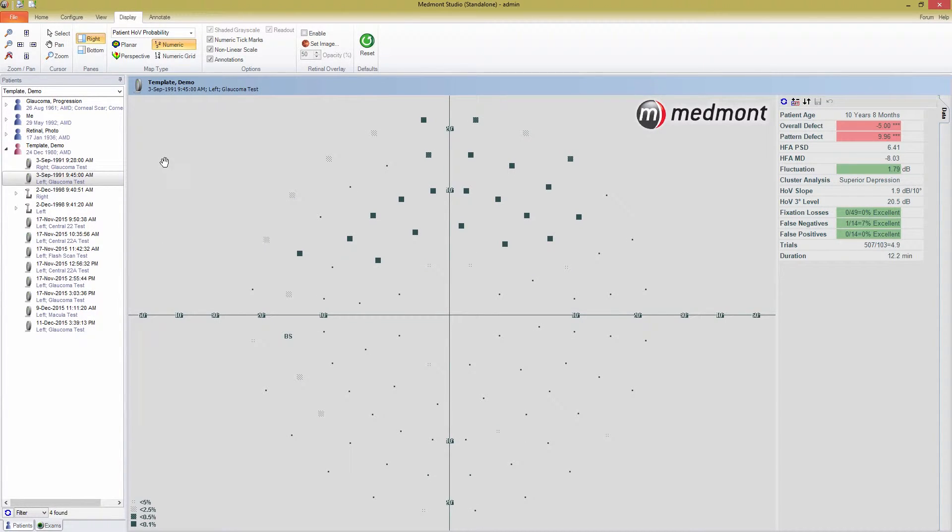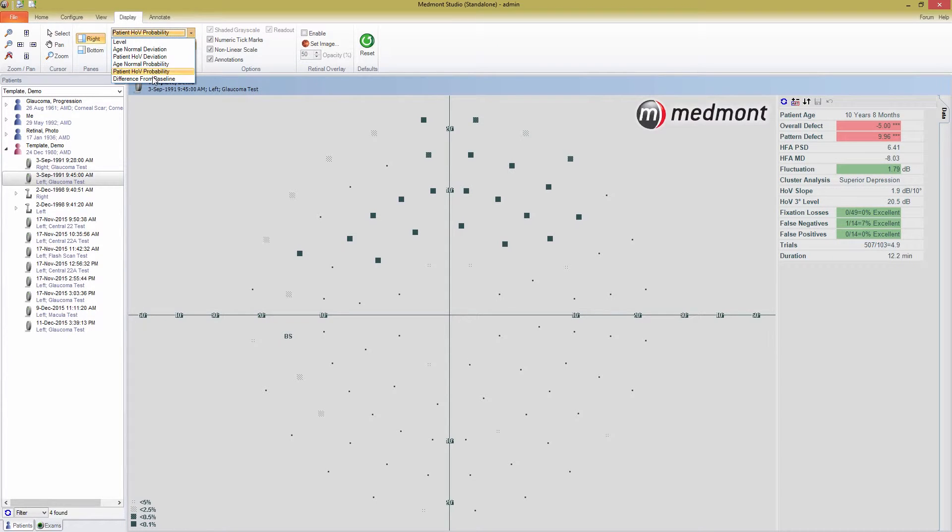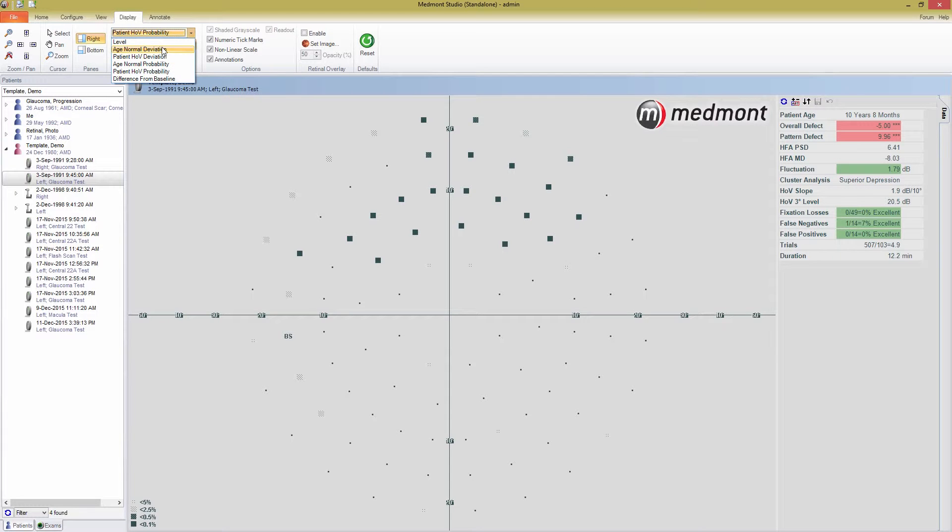The second probability map is the patient HOV probability. This is similar to the age normal probability, but evaluates the significance in a point's deviation from the patient's hill of vision. The final map type is difference from baseline, which I'll save for this tutorial on disease progression analysis.